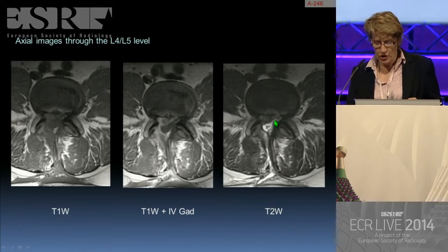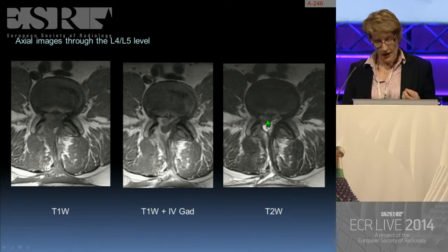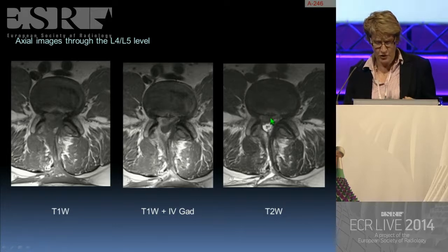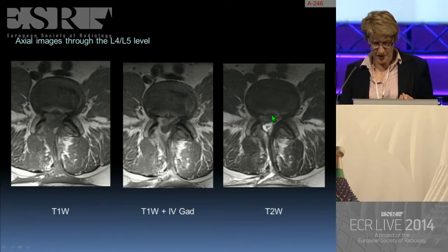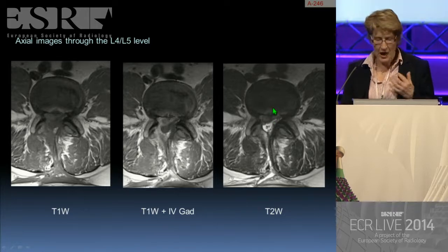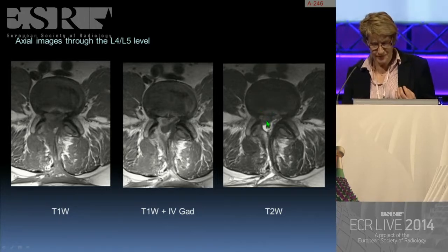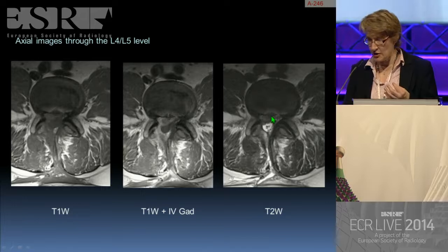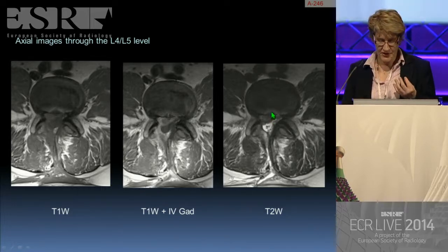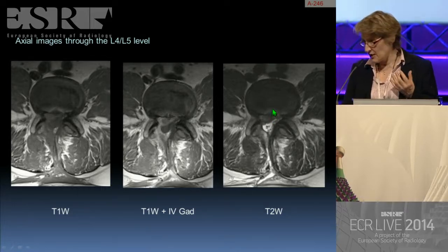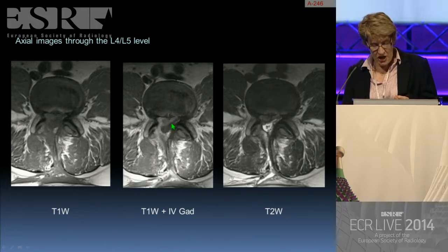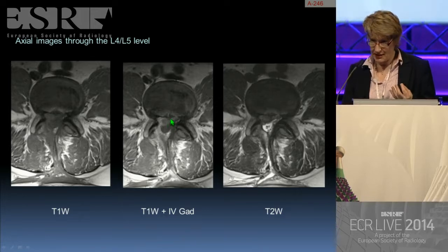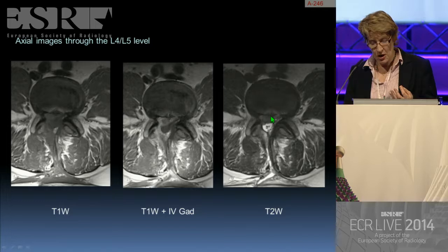We have an extradural lesion, extradural pathology here, compressing the right side of the thecal sac, just in the region of the exit point of that L5 nerve root. If this was an epidural abscess, on T2 we would expect the signal intensity to be high signal — a fluid type of signal — and we might expect peripheral enhancement, but it's not quite the right signal to be an epidural abscess on the T2-weighted study.